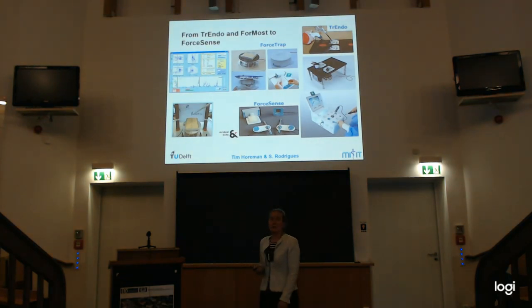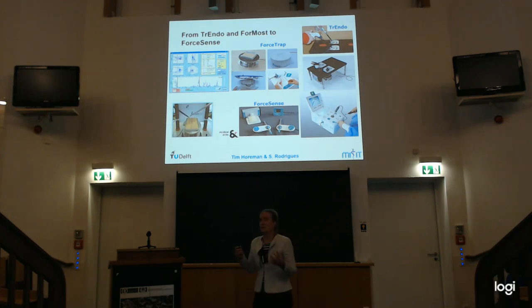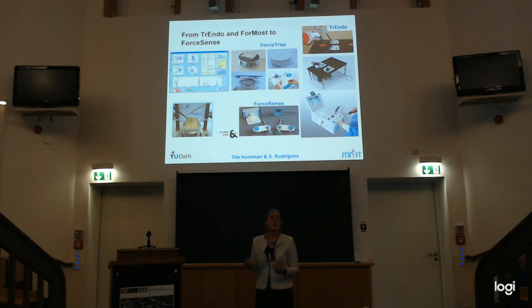But developing such a training system is not easy. I think it's already about 15 years ago that we started with this one, measuring the path length. Also a simple system with an optical sensor in it. That was further developed in this one, and then further developed in this piece. So there are a number of steps before we have the first idea. I think in the end it was 5 prototypes in between before we had the final version.